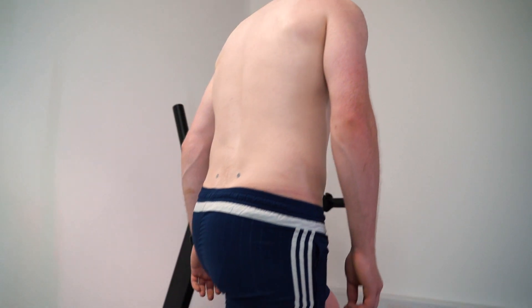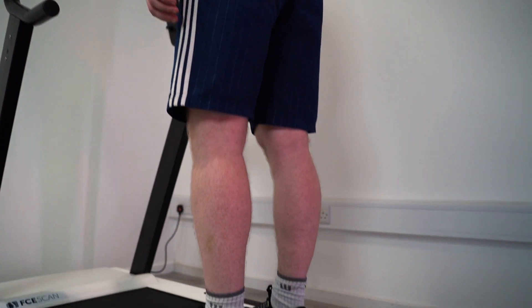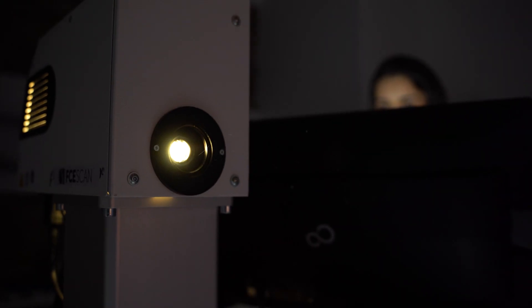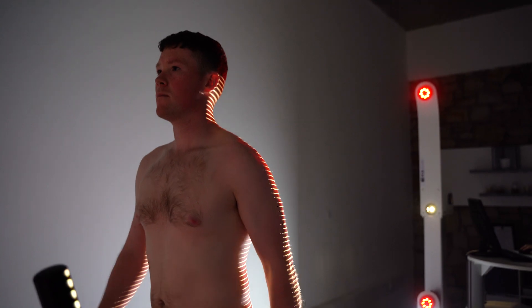The scanning system itself is FDA and medical device directive approved. Our services are provided by highly qualified and trained professionals. We commonly see people with recurrent injury or pain.